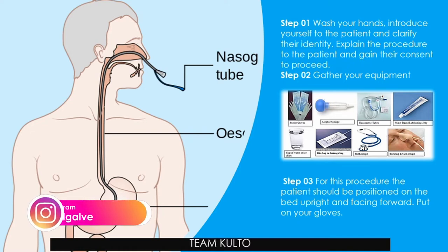Now, step number one. Wash your hands, introduce yourself to the patient, and clarify their identity. Explain the procedure to the patient and gain their consent to proceed, okay? Importante yon. Identifying yourself to the patient and identifying the patient. Ayaw mo naman mag-bigay ng NG tube sa pasyenteng hindi naman talagang in-advise for NG tube ng doctor. And then, what else? Always wash your hands, of course, to minimize the spread of infection.